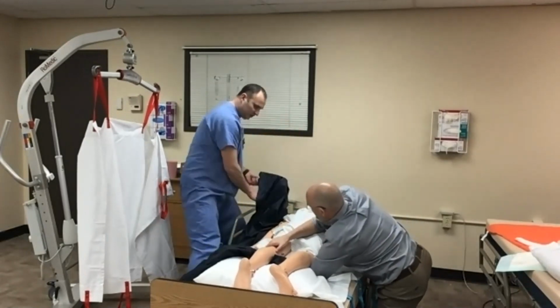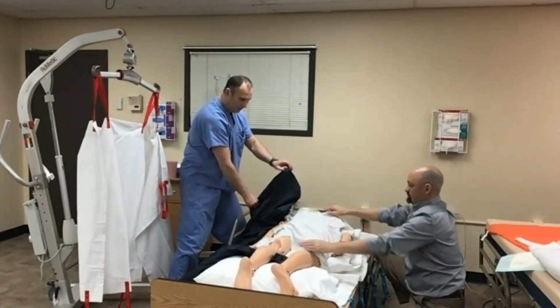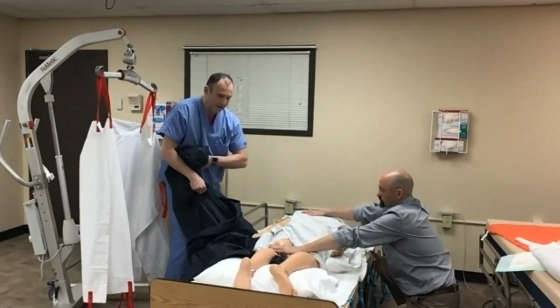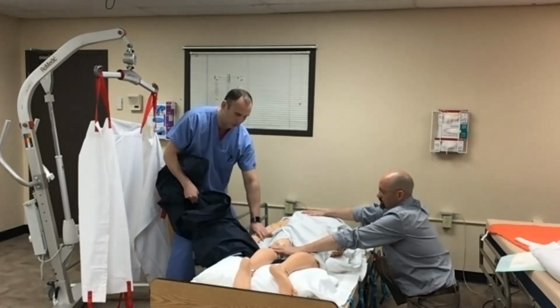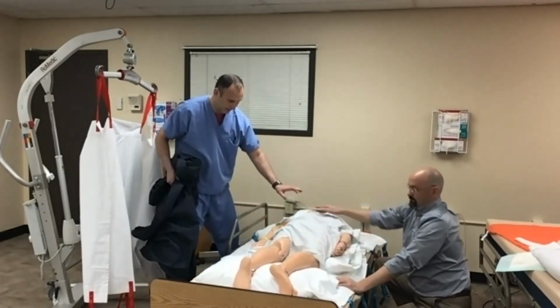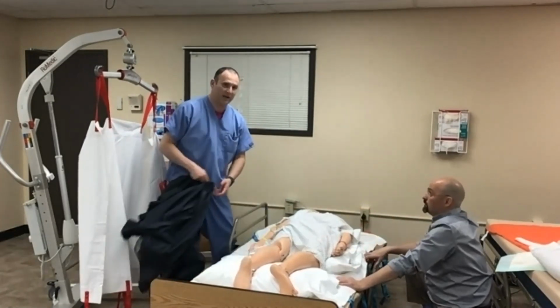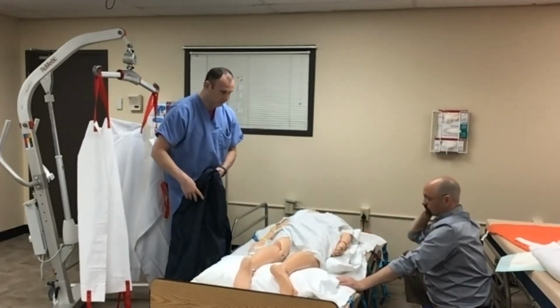Now I'm not going to slide the top portion. I'm going to take the bottom portion of this and just pull on itself. It's just going to come right out, sliding against the top portion, nice and easy. You can see the patient didn't even move. It's not the tablecloth trick. I'm not standing and yanking. It's just a nice, easy pull.